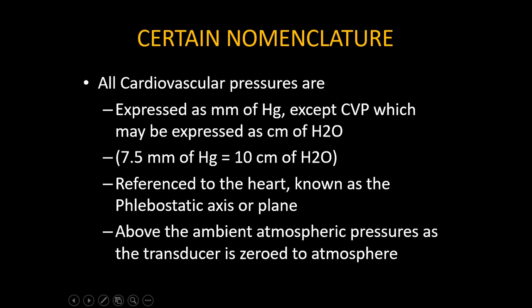Monitoring now. Before we start the basic hemodynamic monitoring, we have to revise certain nomenclatures.